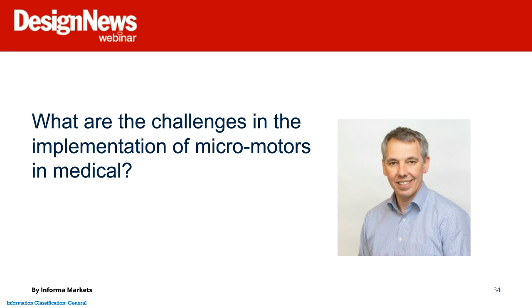And we can push the limits, of course, but every scaling factor will bring you down. The smaller you go, the power that you can get out of a drive goes down by a larger factor. For example, if you have a 6mm motor, you can get out about 0.8 watt per millimeter. That's about the power density that is possible. If you go only 2 millimeters smaller, say from 6 to 4 millimeters, this value drops to 0.064 watt per millimeter. And by that, you can already see how big of a challenge that is.